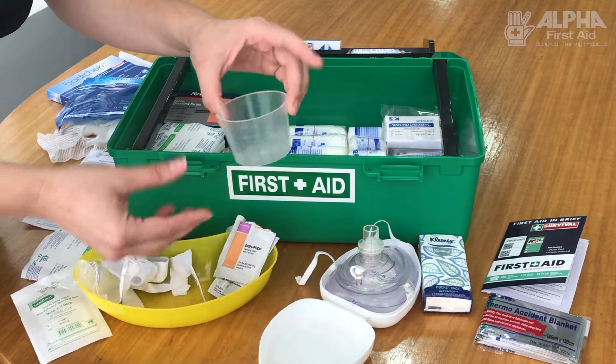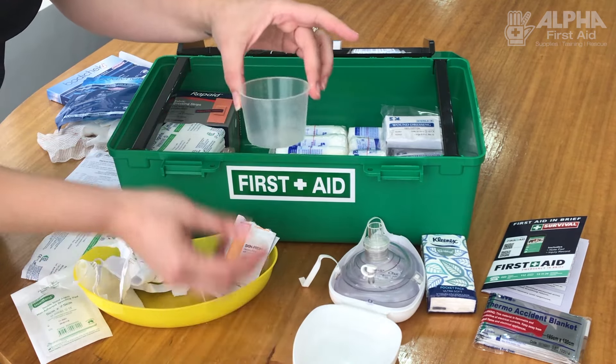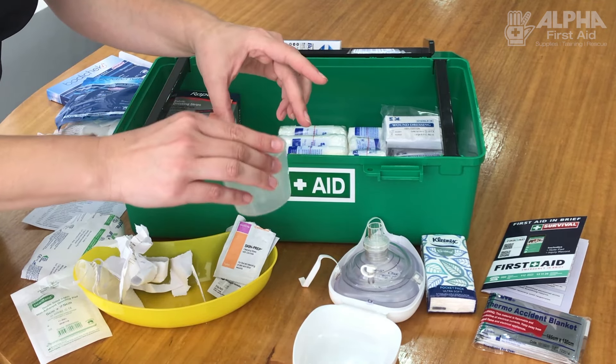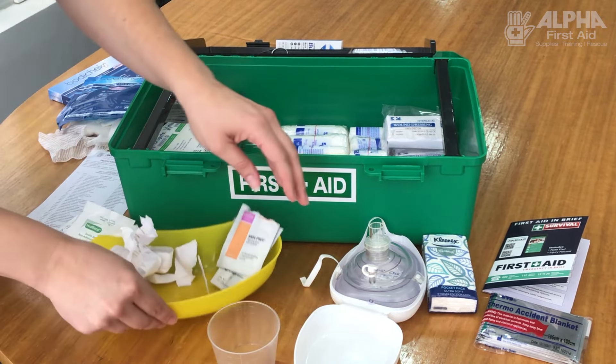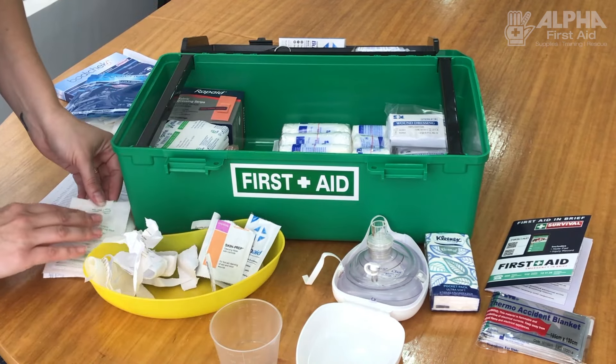The kits also come with a small thing called a galley pot — it has a measure on it, so if you need to use it for fluids to rehydrate somebody or for any form of liquid. And there's your kidney bowl, which holds all of the dressings and the empty wrappings, and your antiseptic.